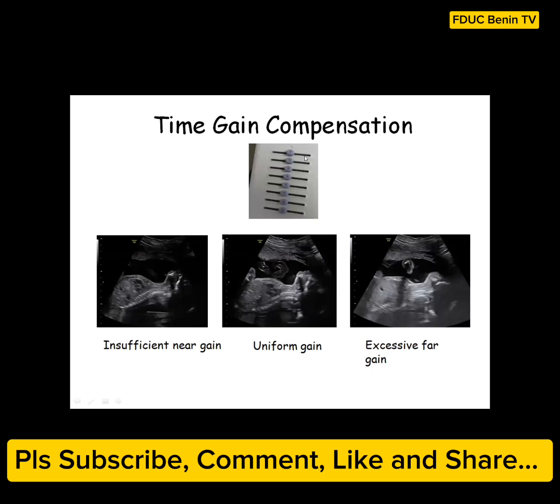So the whole idea is to use this knob when you really want to look at a particular depth, and make sure that everything is uniform. So you adjust the gain to suit all the areas of interest that you are studying. In that way, you will be able to have uniform gain.